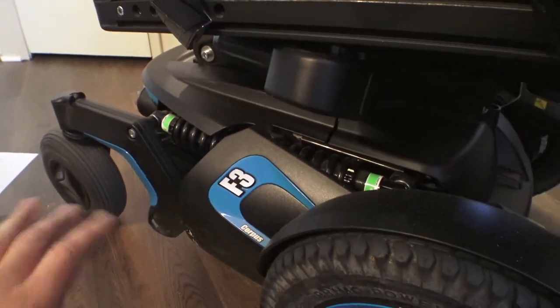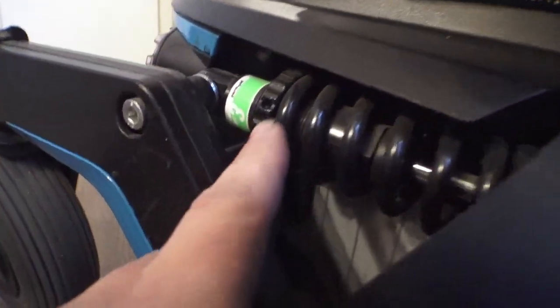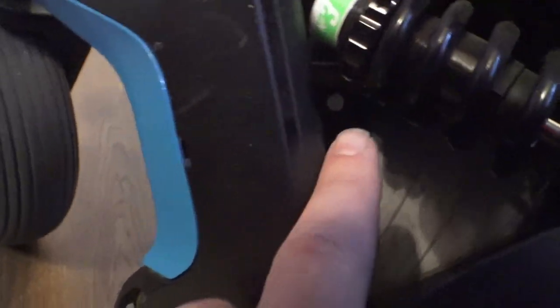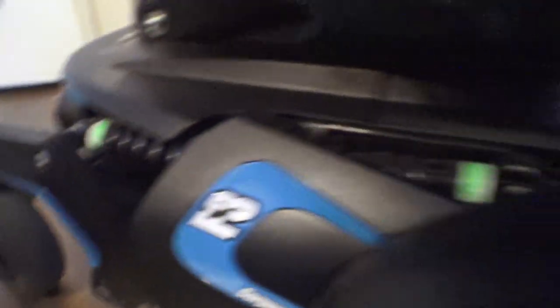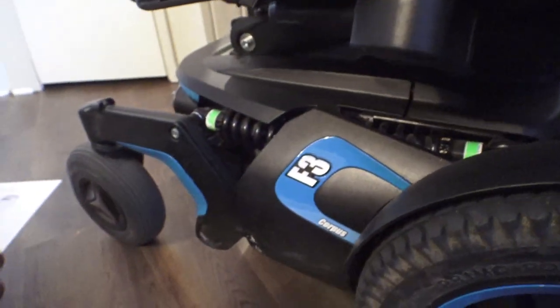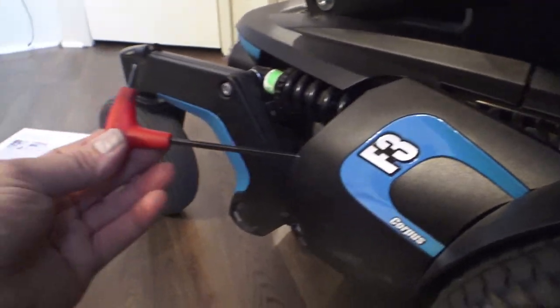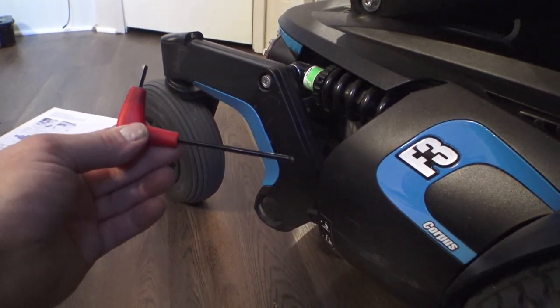On the F3 chairs they have four shock absorbers, two on each side. The adjustment collar on the front one is facing forward, and the adjustment collar on the rear one is facing backwards. If you notice there are little holes in various places around these collars. I was assuming there were some sort of set screws in there, but no — those are just indentations to get the shock adjuster tool in there.